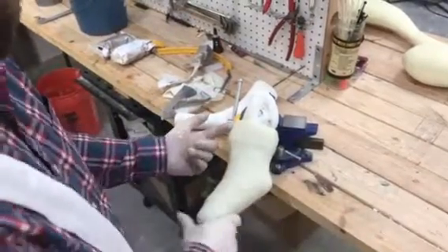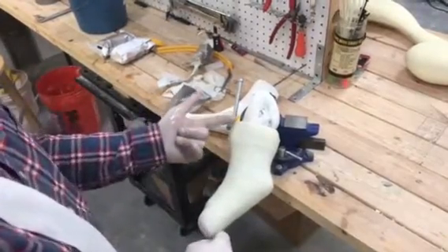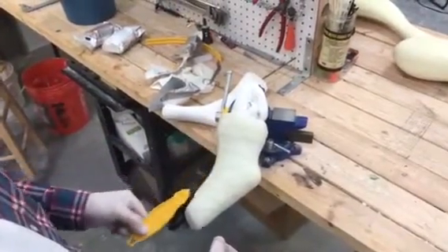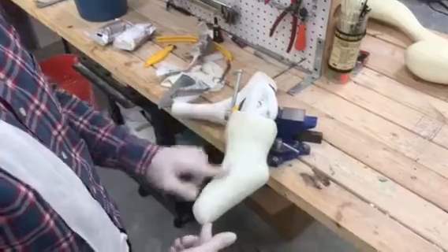From there you wait about two to three minutes until it dries, then use your normal cut tool. Go right down the front and cut that off and remove it from the leg. And that's the easiest and best way to make a mold for a forelimb prosthesis.